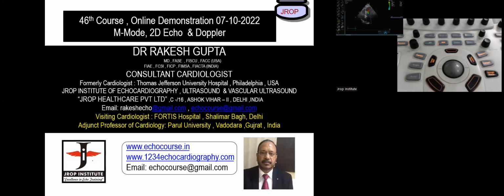All of you can see a screen right in front of you. There are two screens right in front of you. The first screen is on the left-hand side, where you can see a live image. This image will change automatically a number of times. It will all depend on what kind of things we want to demonstrate, on what place we would like to focus, and that's how it will be going in a specific fashion.